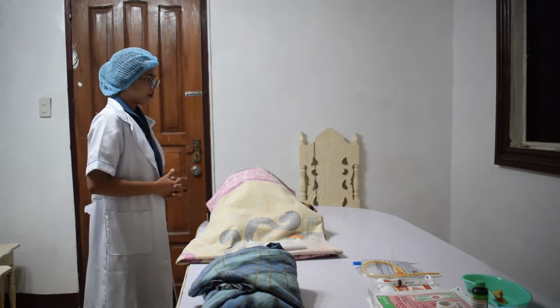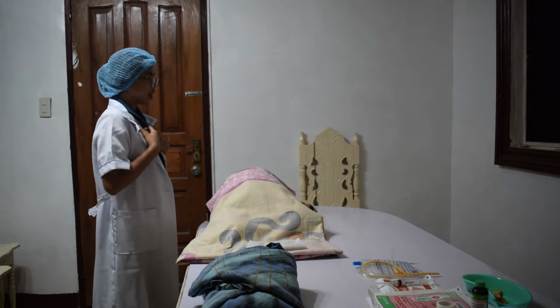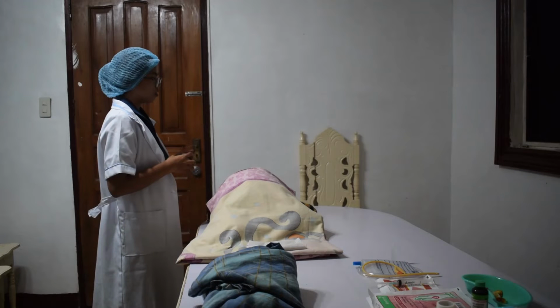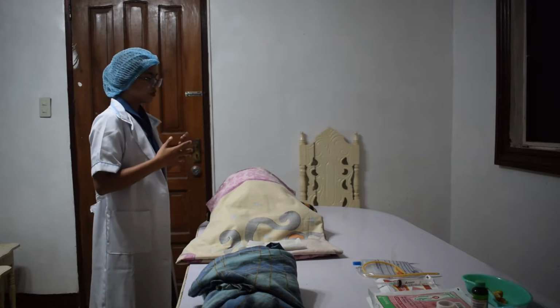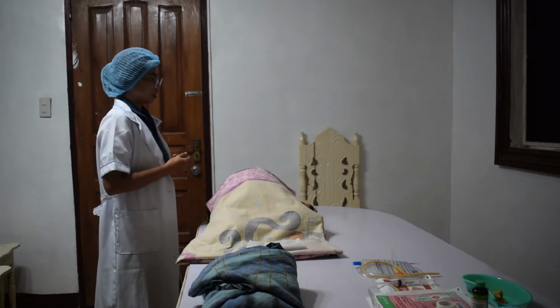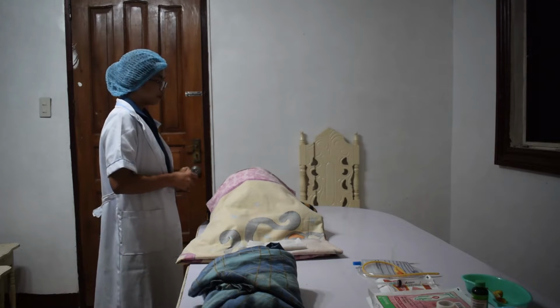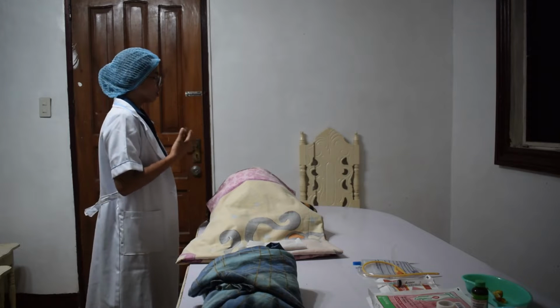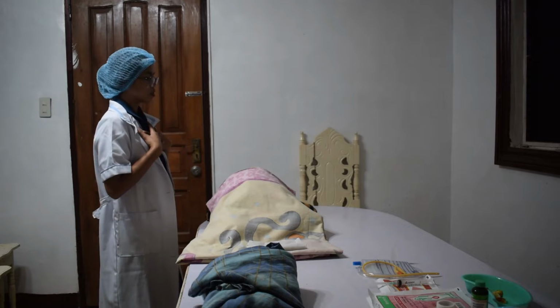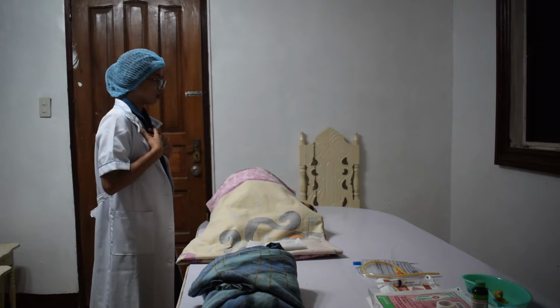Good morning po, ma'am. I am GSDMSFI ASAT. I am a student nurse. Now I'm going to assess you for our return demonstration. We're going to be inserting a Foley catheter into your bladder today. Is that alright? Okay. If you have a concern or discomfort while I assess you, tell me so that I can assist you. Okay po, ma'am? Okay.